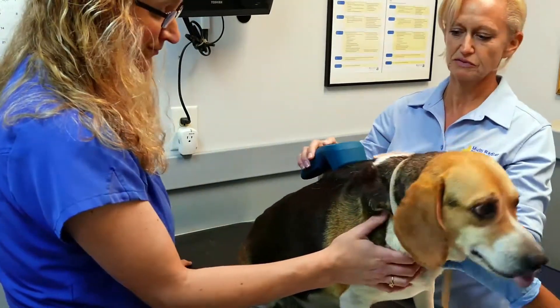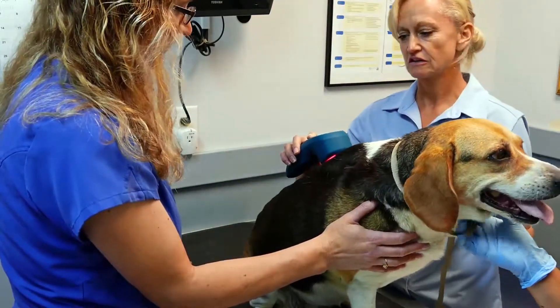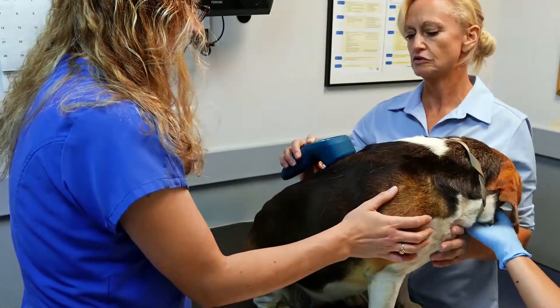She's a beagle — beagles are busybodies. So, whilst we're standing here, as far as the laser goes, you can enable yourself to not have to rely on the protocol manuals so much.